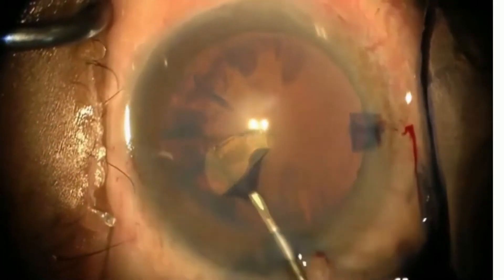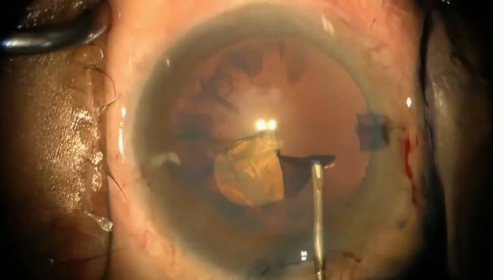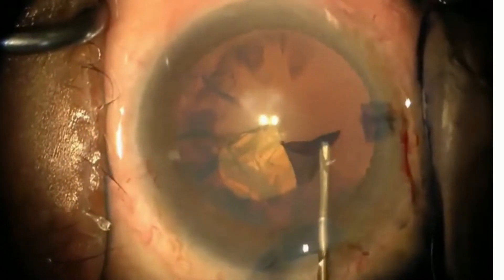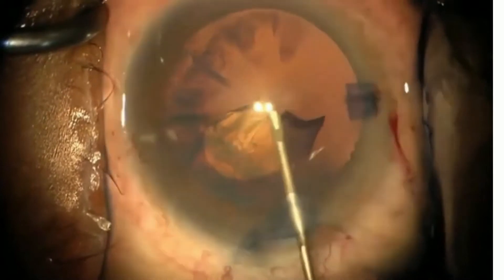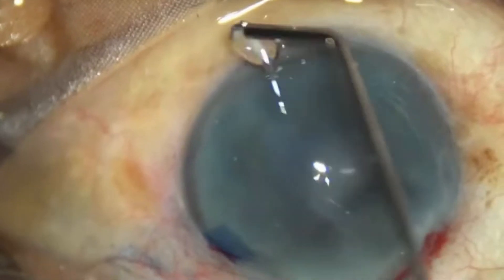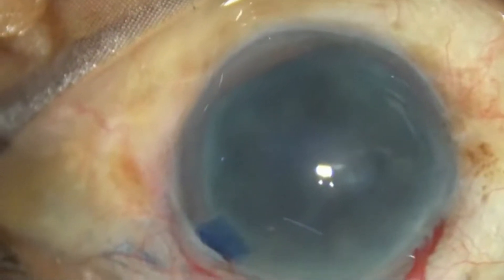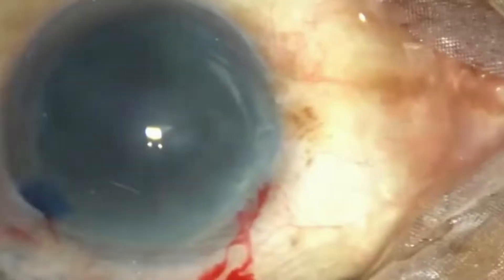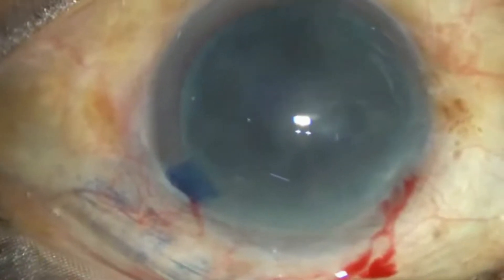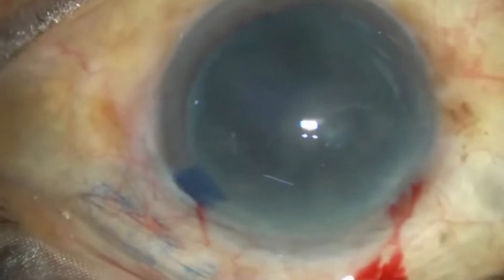Development of continuous curvilinear capsulorrhexis, or CCC, has significantly contributed to the safety and effectiveness of modern cataract extraction by phacoemulsification. Since it was first described by Gimbel and Neuhann, CCC has become the technique of choice for anterior capsulotomy.